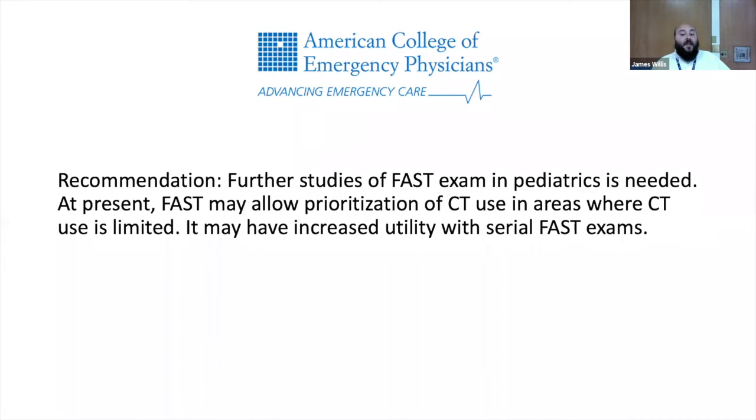They found that many of the pediatric studies apply different definitions, gold standards and outcomes than the adult studies, which makes it difficult to compile large systematic reviews to get accurate information. So ultimately what they recommend is that we really need further studies of the FAST exam in pediatrics. And currently, the FAST exam should be utilized to prioritize CTs in areas where CT use is limited. They also say that if you use the FAST, you can increase its utility with serial FAST exams.